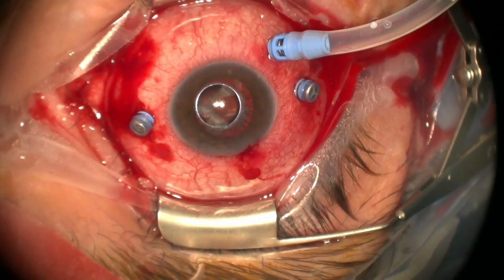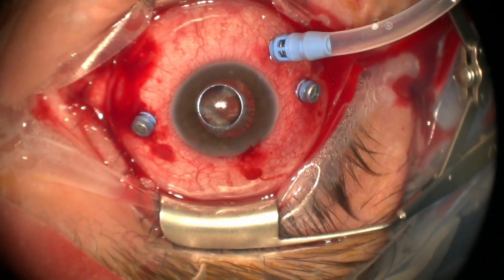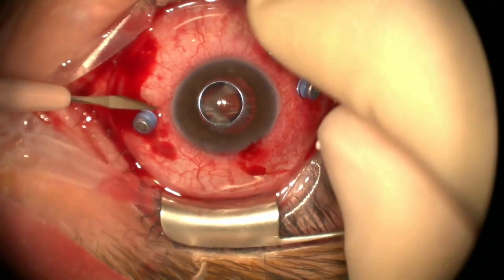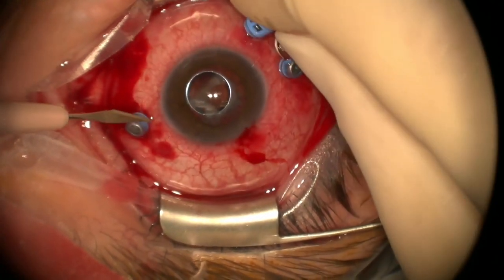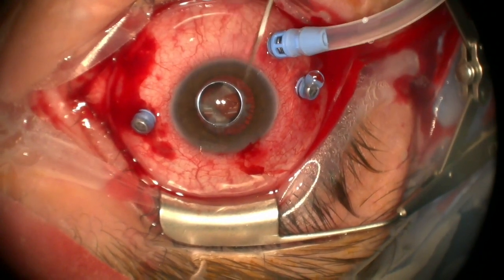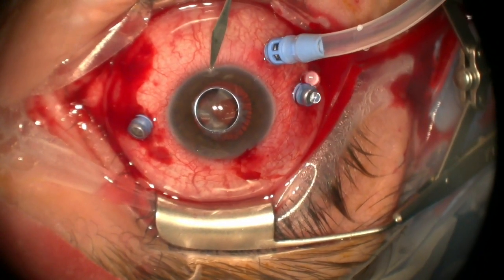Now let's take the oil out of the anterior chamber. If you can wet the cornea for me. We're gonna get this oil bubble out. Just kind of look which way the eye wants to rotate the most easily. It kind of wants to go this way. So I'm pretty happy to let it do that. I'm just gonna make my incision right here.